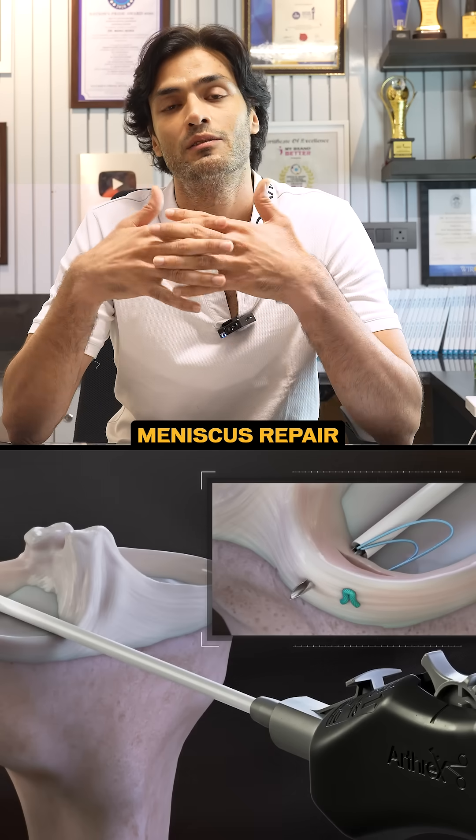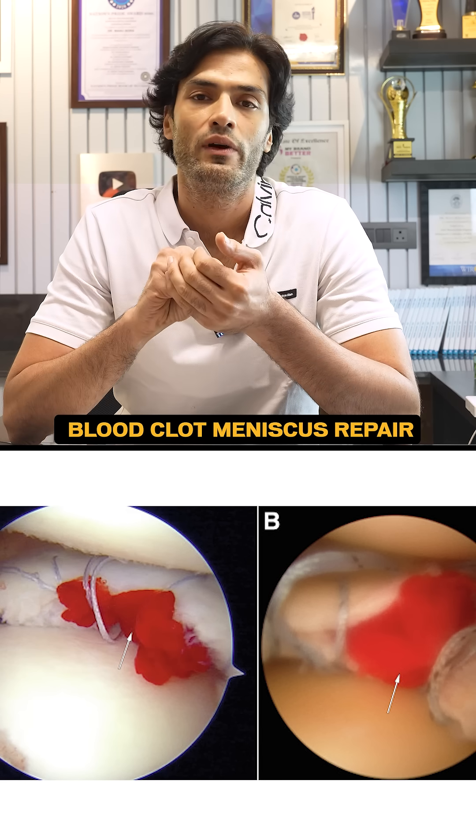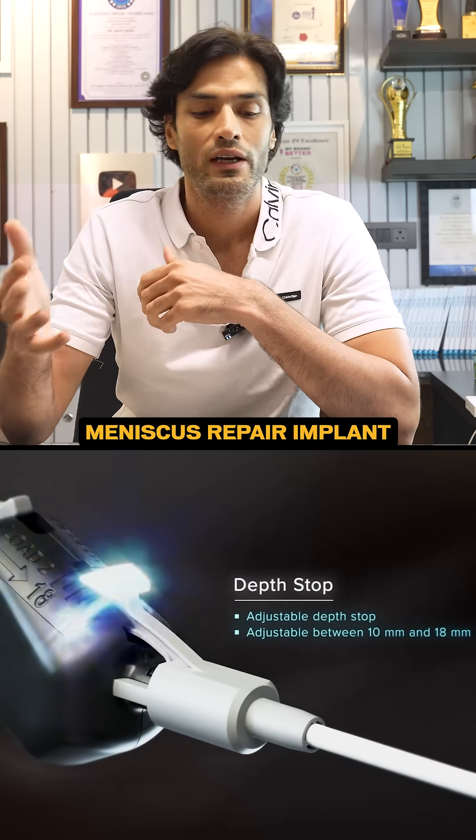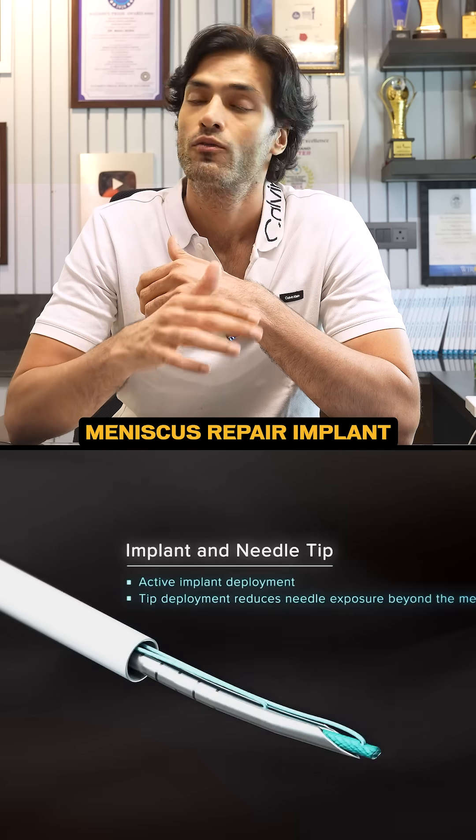How the meniscus is being repaired? What is blood clot meniscus repair? What kind of implants we use in meniscus — from all inside to inside out, to outside in, from the zone navigator, from everything.